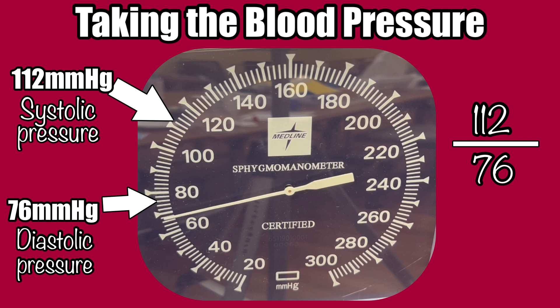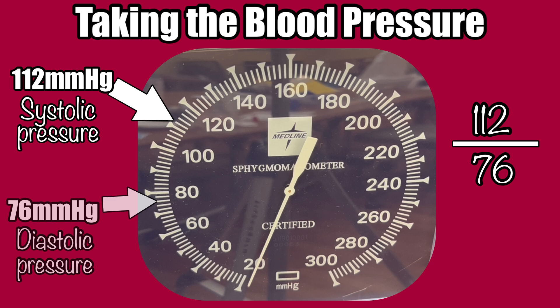Now you can open the valve further to completely deflate the cuff, and remove it from the patient. Quickly jot down the numbers, or verbalize them, before you forget. If we look at our example here, the top number, or systolic pressure for this patient, is 112 — that was the pressure when we first heard the pulse. The bottom number, or diastolic pressure, was 76 — that was the pressure when we heard the last thump of a pulse.